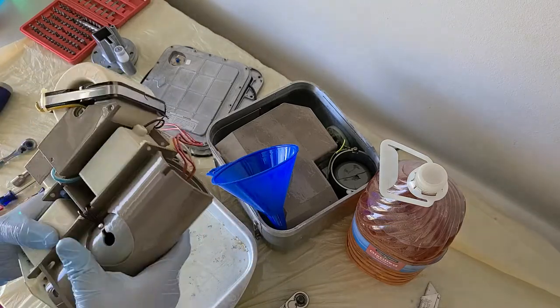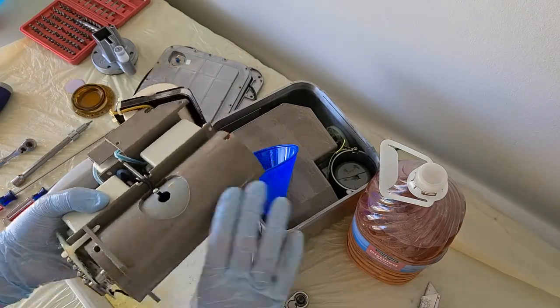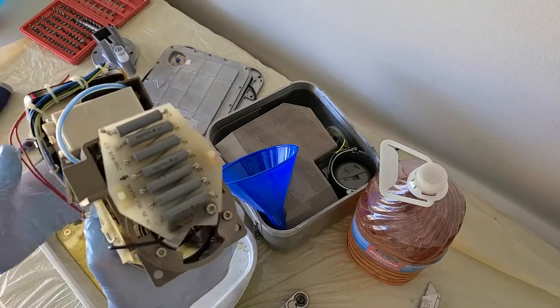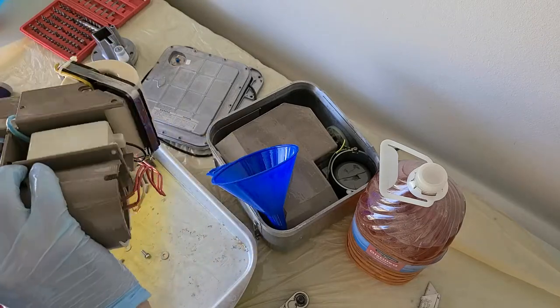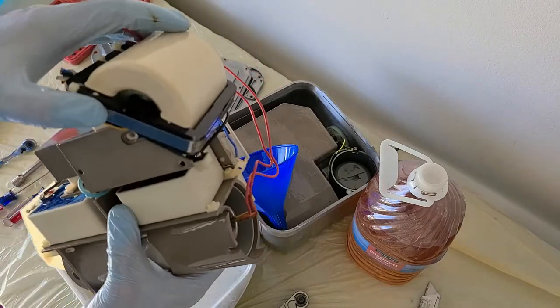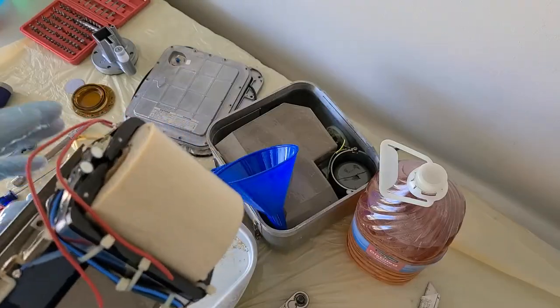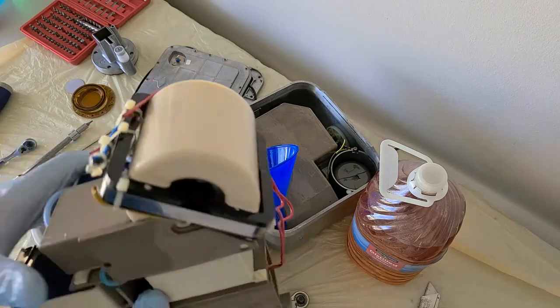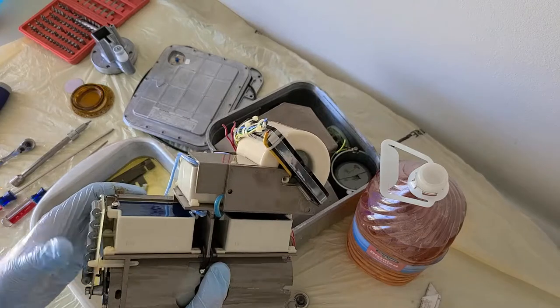All right, but yeah, my x-ray tube is almost free, it's just right here in this housing. There's a few screws that look to be holding it in and then we'll be done getting the tube out of it. Not sure what this is, some kind of coil. There's cables inside of here, I can see some kind of cables, but I'm not worried about that. I don't really care about anything else, I just want to get the tube out for my collection.